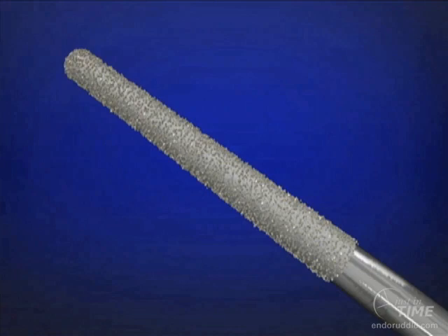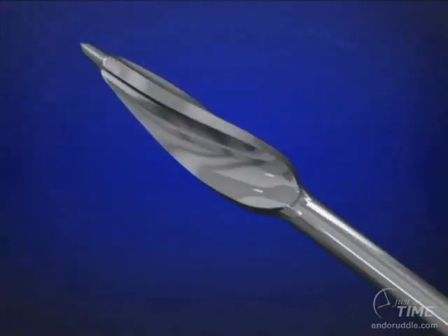Anybody can basically make a hole in the tooth, but your great clinicians finish those holes exquisitely because a flat axial wall refracts light, and when we refract light, we see fractures, we see little nuances that can help us be better diagnosticians.